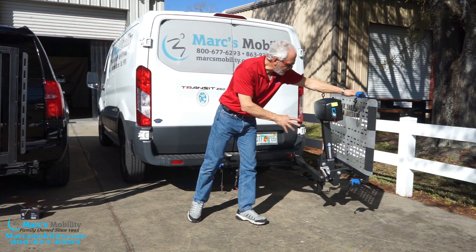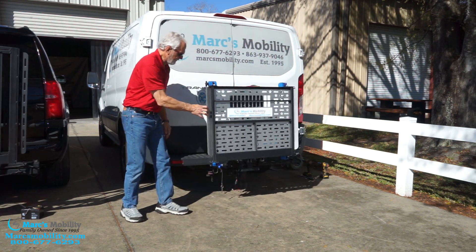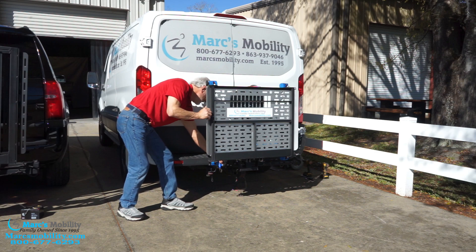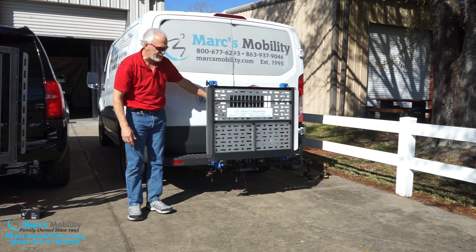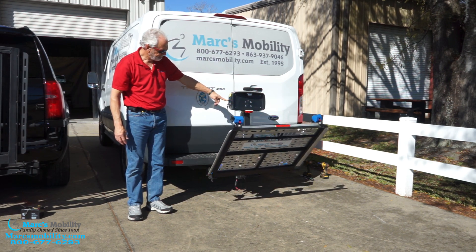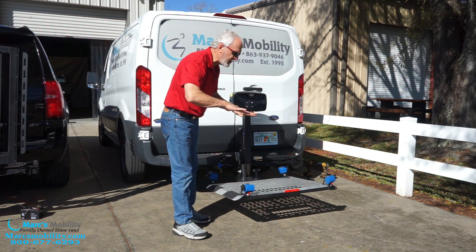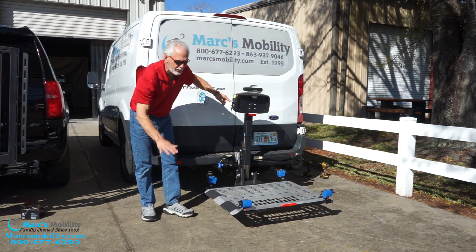This lift is very easy to operate. I'm going to shut it now — it should shut this easy. Then you just put the pin back in. Now I'm going to turn the key on and push the lift down — it's an automatic lift. You'll see how you have a nice tilt platform. When it goes down lower, you will lose that tilt and it'll tip down, but that's normal.